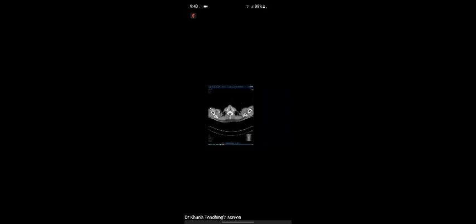Okay, so looking at the CT scan, there are multiple destructive bone soft tissue densities based in the rib cage with destruction of the adjacent bone, and they're more apparent. I can also see a right paraspinal mass. In the left kidney, there is an enhancing mass, and I would like to review it better. Yeah, so there is an enhancing mass, and it has sort of a central enhancement. I'm suspecting an RCC in this instance.